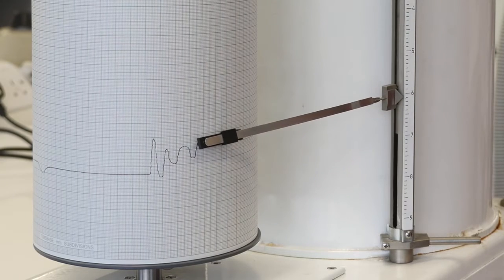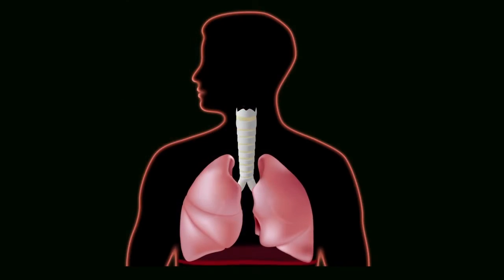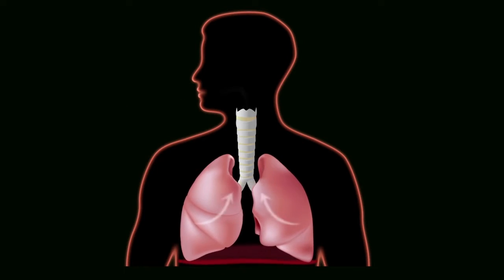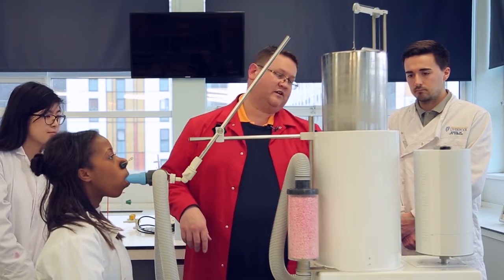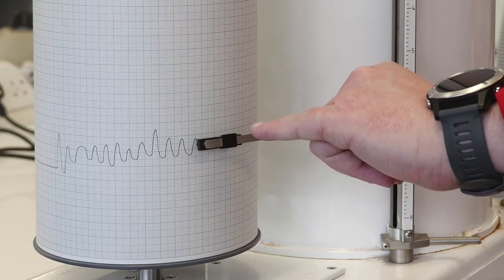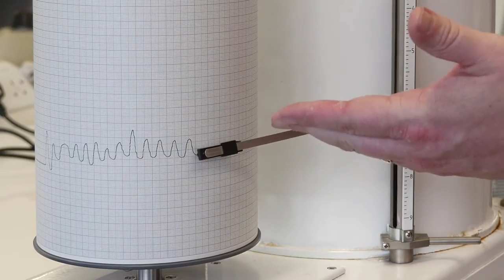So what you can see is as you're breathing in and out, you've got the bell moving up and down, and that is a direct reflection of the changes in lung volumes as a consequence of the pressure and volume changes happening in the lungs. The chart recorder is linked to a pen on the balance side of the drum, and so it allows us to see directly what's going on with the inhalation and exhalation. We call it tidal volume because it's almost ebbing and flowing, and you can see it on that side.